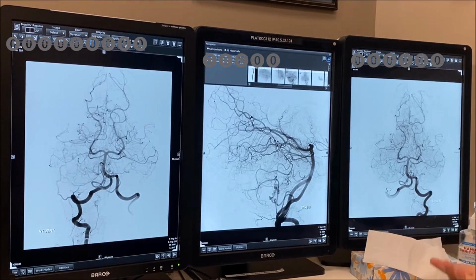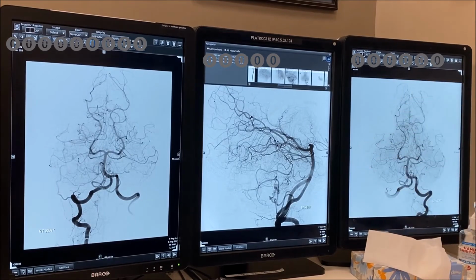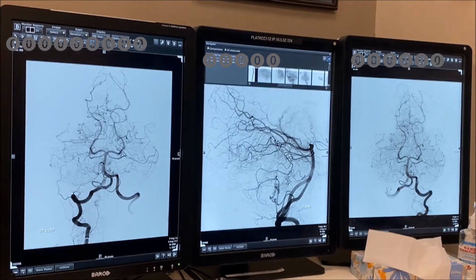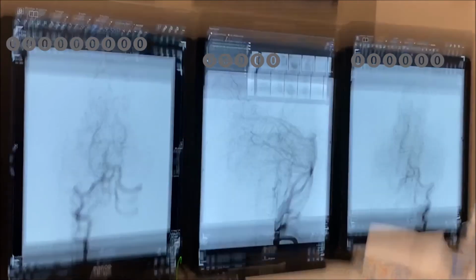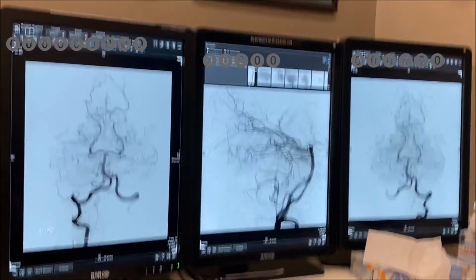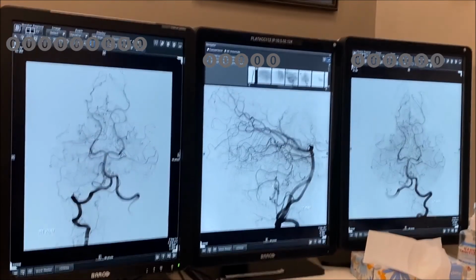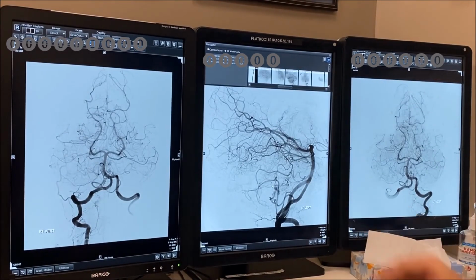Yeah, I mean, whatever, this is a dysplastic segment with aneurysmal ectasias. I actually think this could have been a recanalized channel that has vasa. So there could have been, but we don't see in the MR a pre-existing aneurysm with those fusiforms that you see in the MCA that have feeding channels. But I think it's a dangerous lesion. This can rupture. This can create trouble. So one of the things, first I need to understand it better, but yes, sacrificing the vessel. I can't imagine you're going to clip this. I can't imagine you're going to coil this, right?